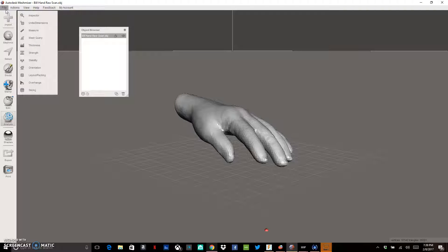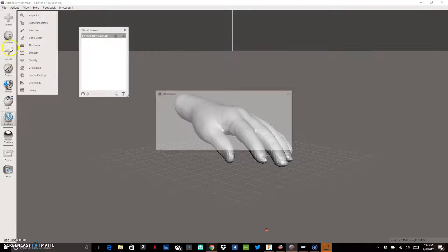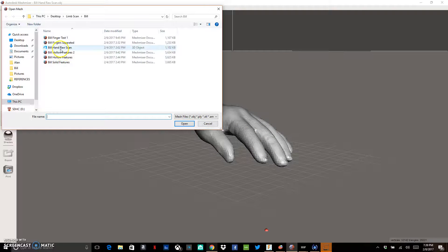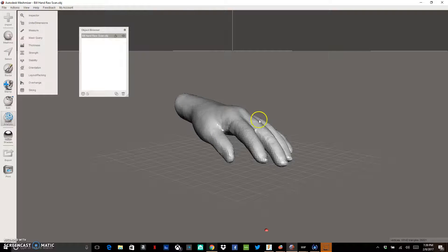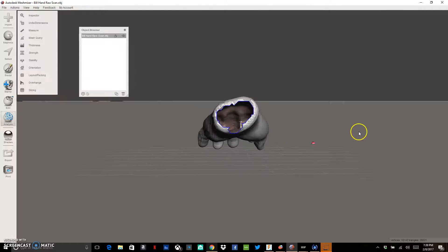We're going to show you how we go about making a cosmetic prosthetic. We're going to start from a scan of an actual hand. First, open up Meshmixer. Once you're in Meshmixer, import your scan. I'm going to import and replace the scan I currently have with this raw hand scan — this is the scan I got straight from my Occipital Structure Sensor.